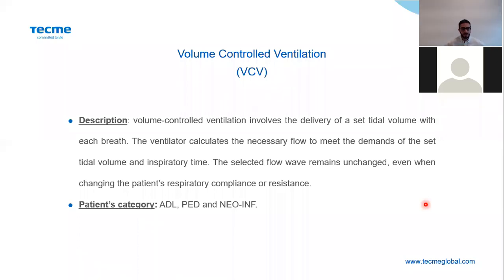So the ventilator calculates the necessary flow to meet the demands of the set tidal volume and inspiratory time. So the flow and the volume breath by breath will be the same. It's the control variable here, but the pressure won't be. It will change according to the compliance and the resistance. This ventilatory mode is available in adult, pediatric, and neo patient categories.